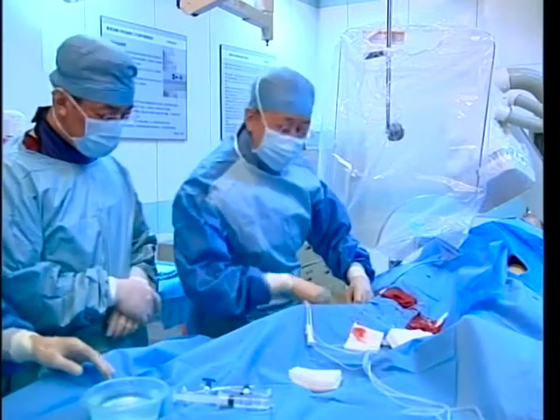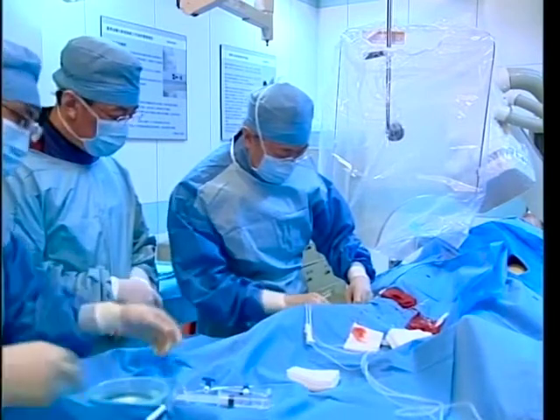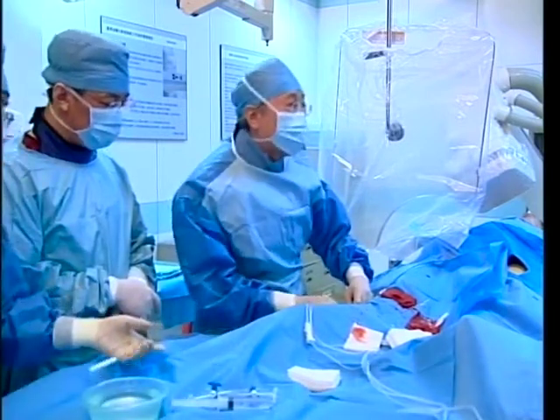Kathleen, do you also do this without echo? Yes, I did it mostly nowadays just local anesthesia without echo.